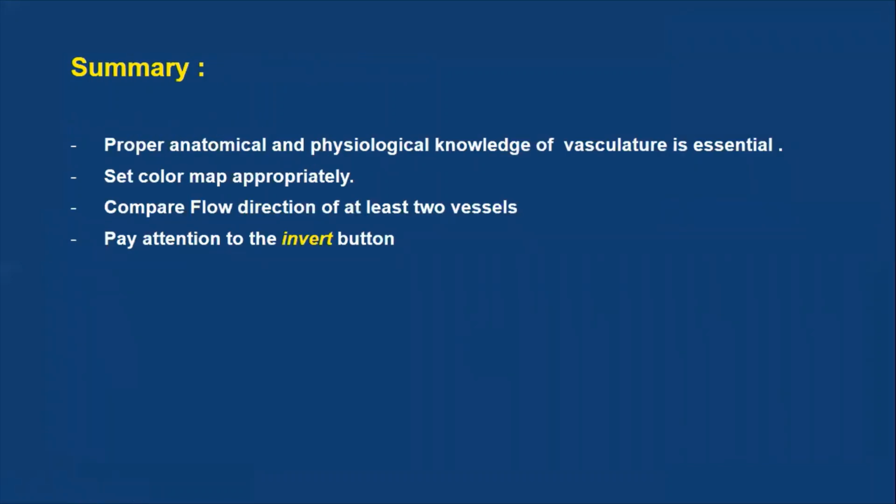As a summary, proper anatomical and physiological knowledge of vasculature is essential. Set the color map appropriately. Compare flow direction of at least two vessels and pay attention to the invert button.